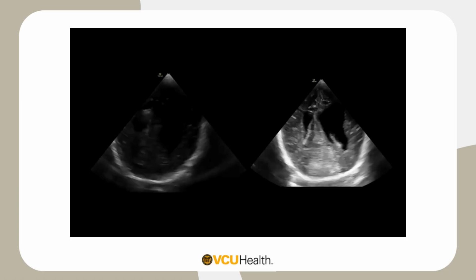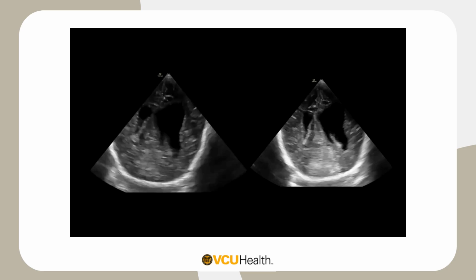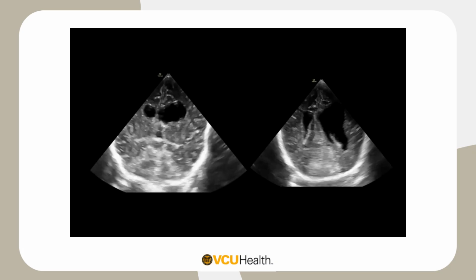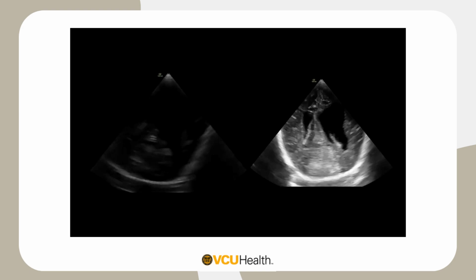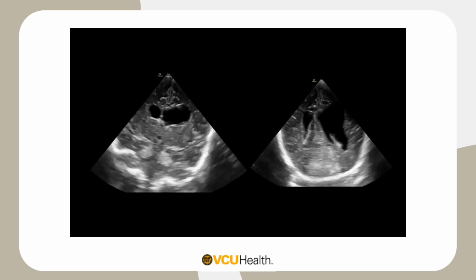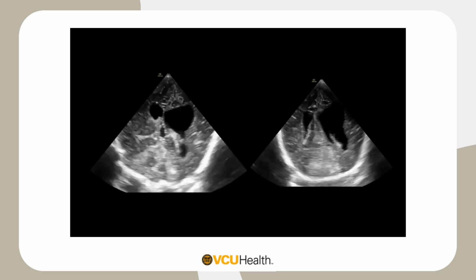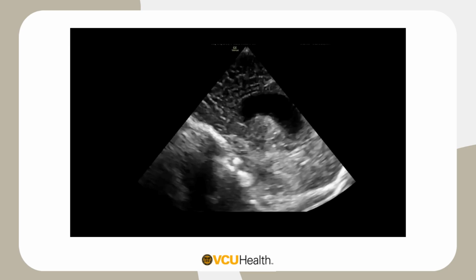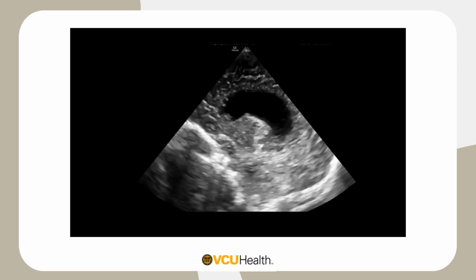Okay. So we do see patients coming in with increased ventricular sizes with shunting. And then here's one patient that we see with enlarging cranial size. And we can potentially compare the different sizes from either the previous CT or the MRI that was done with our findings here using the ultrasound. And again, here is another example of the increased ventricular sizes for our patients.